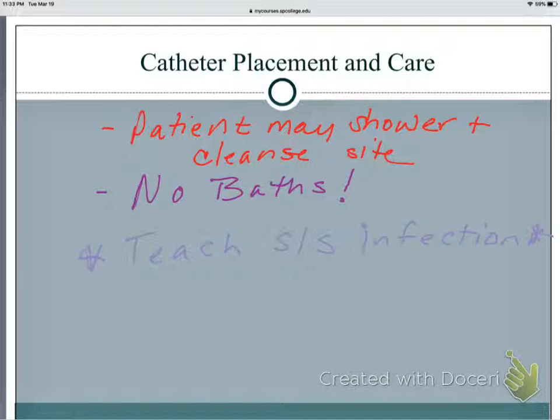But we're going to talk about that. But for basic catheter care, you want to teach them the basics. Most of nursing, honestly, for helping these patients manage their own illness is to really help educate them to manage their own illness. And so education for nursing is a huge part of discharging these patients home with this type of equipment.